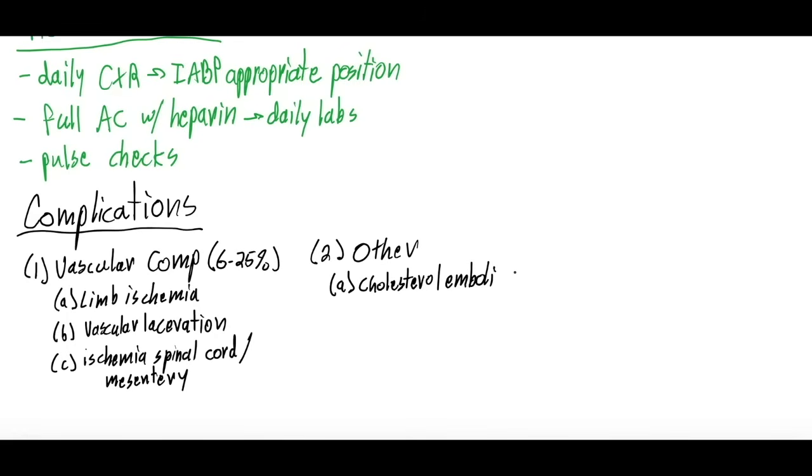You usually have increased eosinophils, and believe it or not, you actually want to stop the anticoagulation if you start to suspect cholesterol emboli, as it can exacerbate things. All right, another thing here, you can get strokes, cerebrovascular accidents. If you dislodge a thrombus while inserting the intra-aortic balloon pump, it can actually shoot up into the brain and cause a stroke. Another one is sepsis, right, which is a systemic infection in the body, especially if it's in place for more than 7 days.